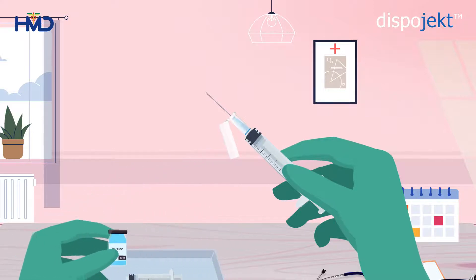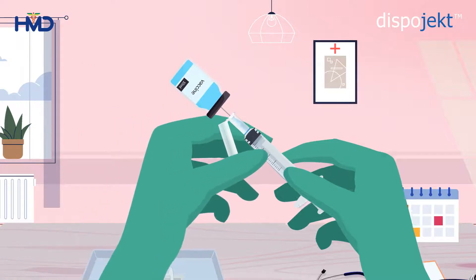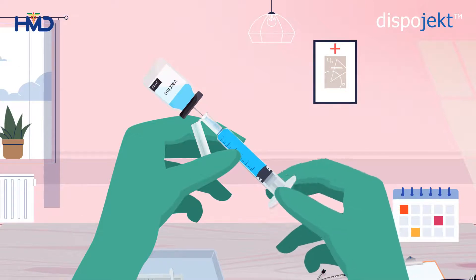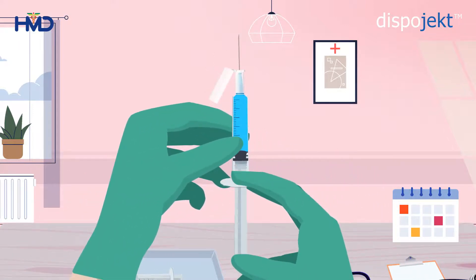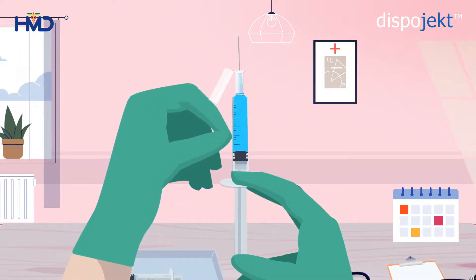Now, fill the syringe with the prescribed medication. Turn the syringe vertically up and position the needle in a manner that allows the bevel to face upward. Tap the barrel to remove the air bubbles from the syringe.